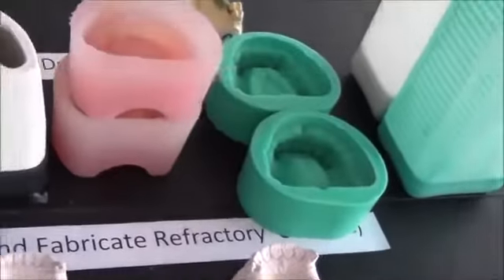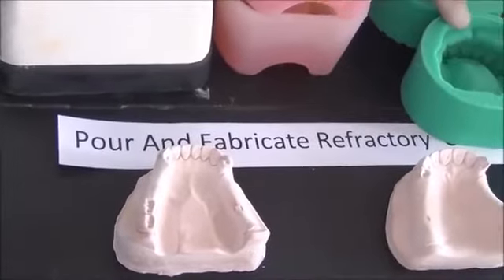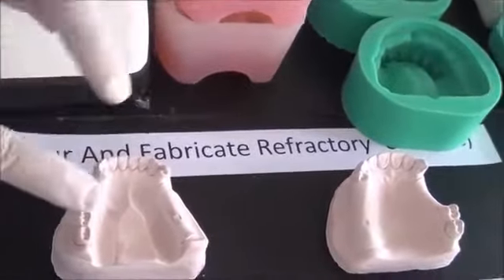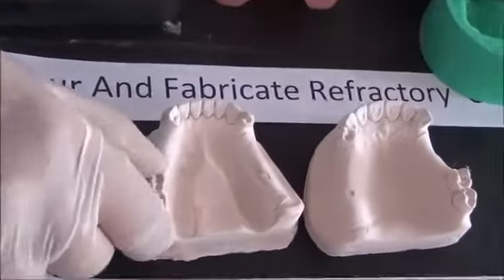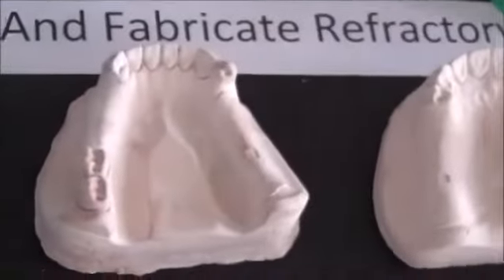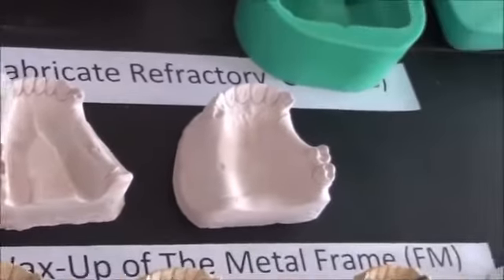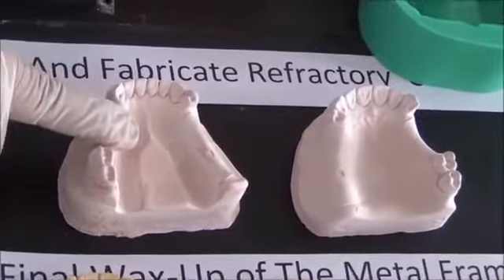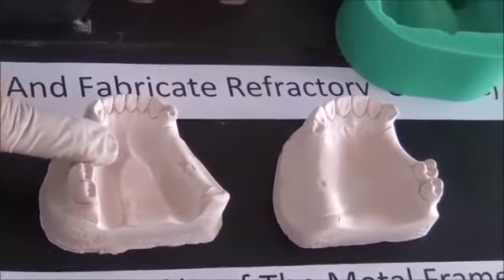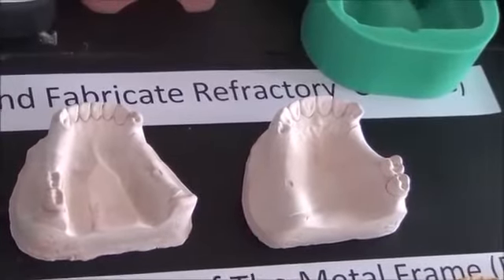The refractory material is another material, powder and liquid, mixed together. Once we pour it inside here, we will get these refractory casts. The main property of the refractory material is that it withstands high temperature, and it will compensate for the expansion and contraction of metal during the cooling process. Please review your dental material lectures and read your dental material chapters about refractory material.